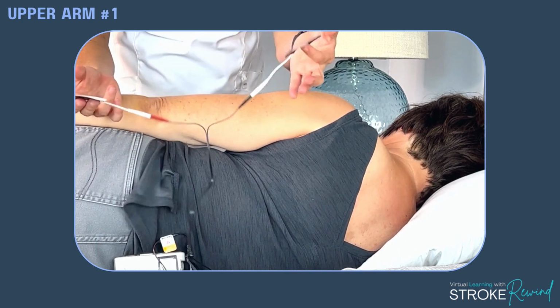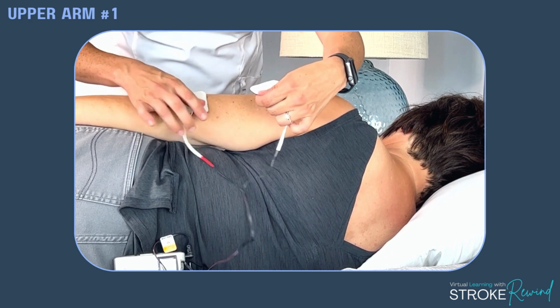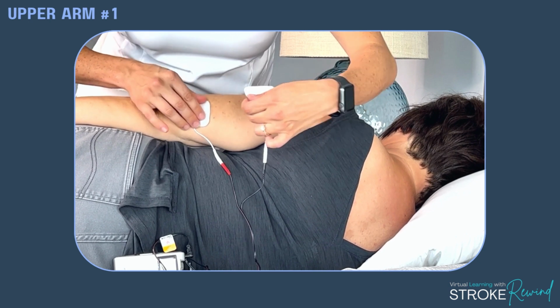So for tricep, again, I like to do black on top and red on bottom. You're going to place the electrodes on a meaty part of the muscle.